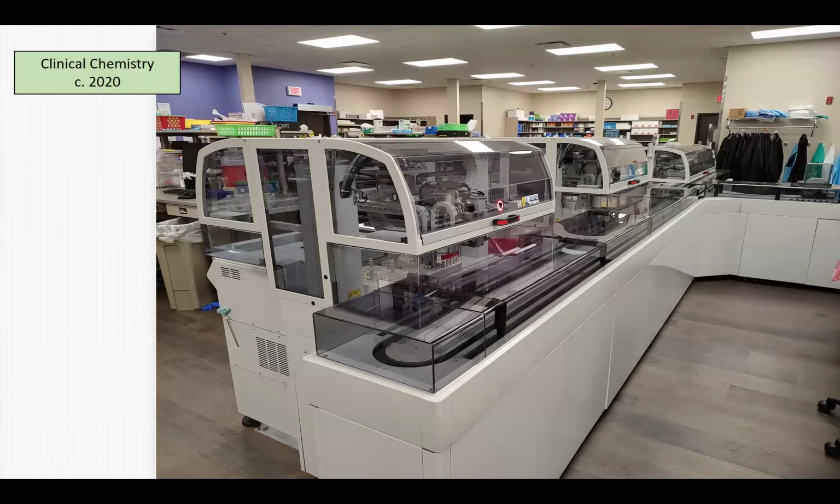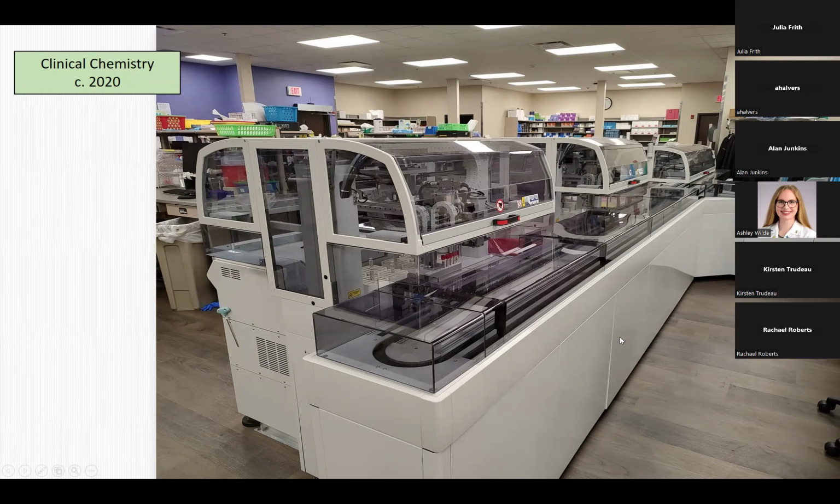Automation in the laboratory is something that's not unusual. It came a long time ago, especially to something like chemistry. This is a picture here of our chemistry lab here at CPA. It's hard to tell from this picture exactly what's going on, but this is a big honking machine here, and the techs will receive specimens over here on the backside. They'll put them on this machine. You can see a few tubes sitting right in here.